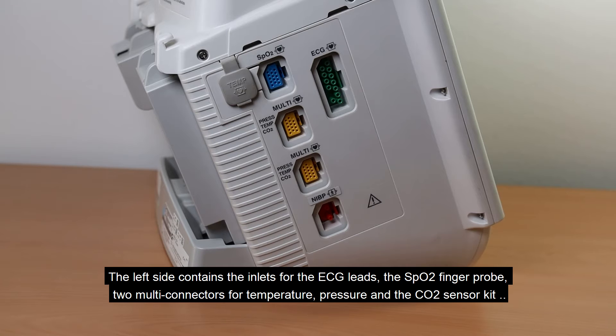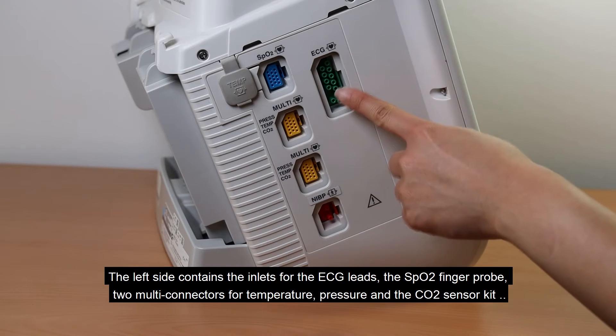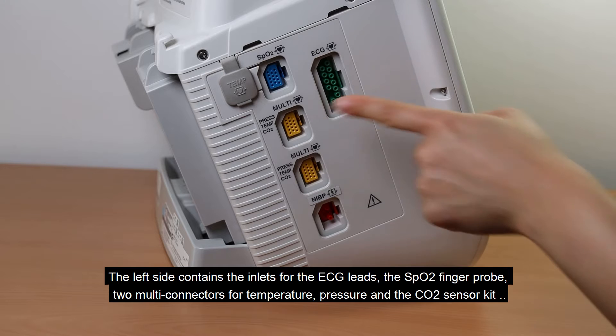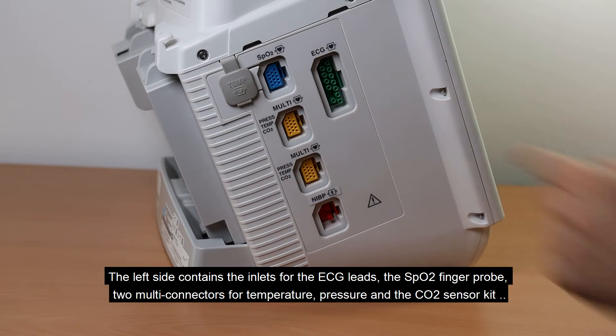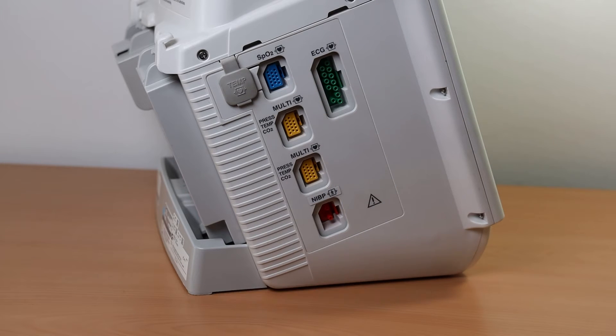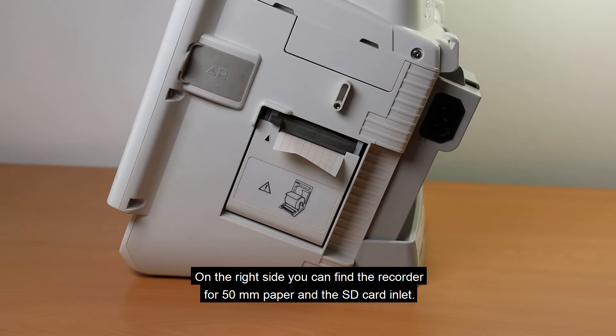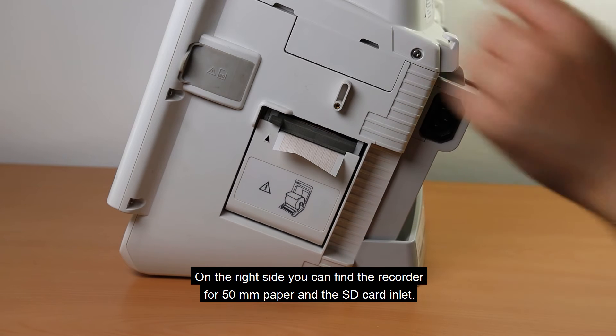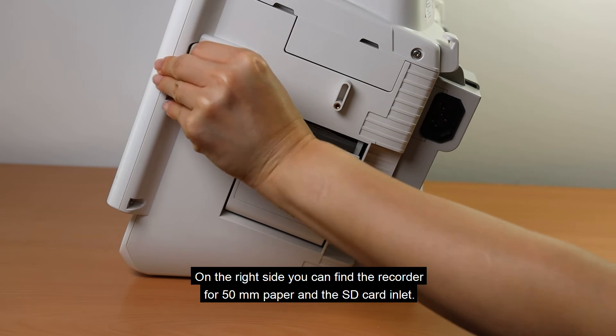The left side contains the inlets for the ECG leads, the SpO2 finger probe, two multi-connectors for temperature, pressure, and the CO2 sensor kit, the NIBP socket, and the temperature probe. On the right side, you can find the recorder for 50 mm paper and the SD card inlet.